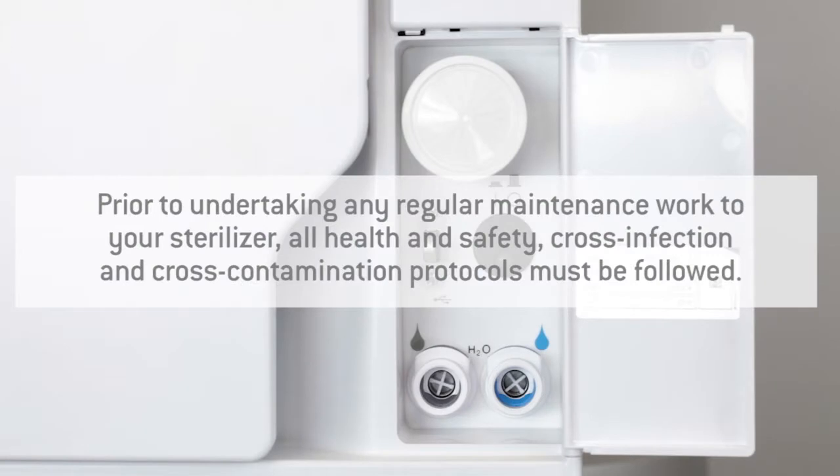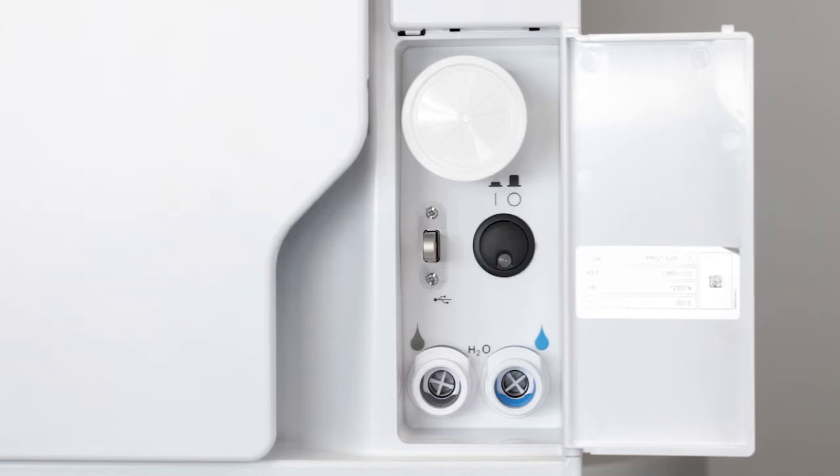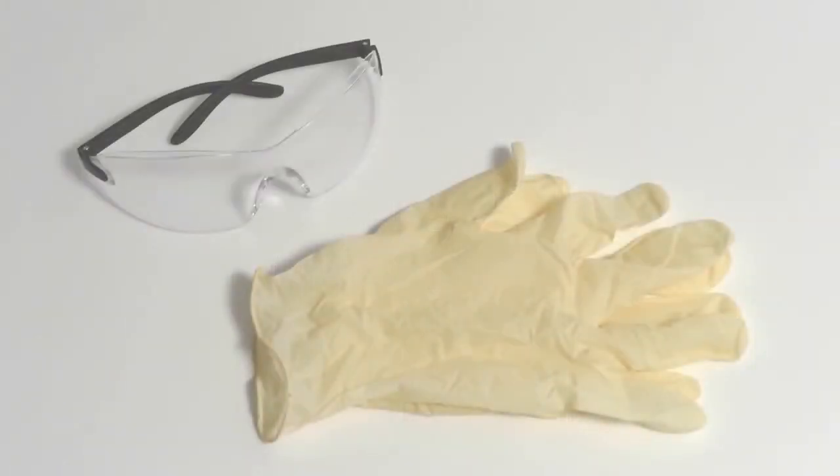Before carrying out regular maintenance on your sterilizer, ensure that current health and safety at work regulations and accident prevention regulations are being observed to avoid cross-infection and cross-contamination. For your own safety, wear protective gloves and goggles at all times.